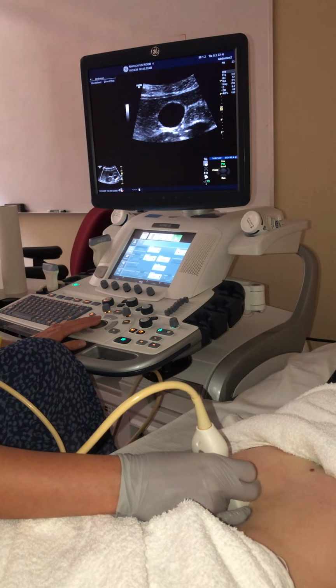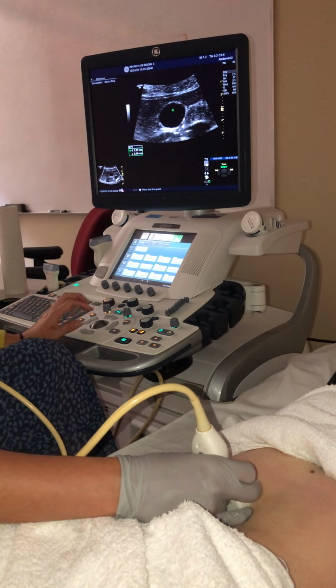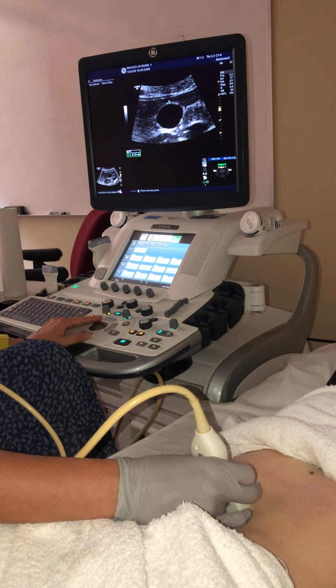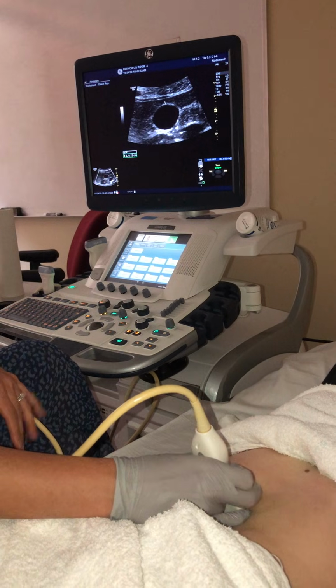We measure the anterior wall outer to outer. We want that less than 3 millimeters. So we're going to measure that echogenic wall, and she's at 1 millimeter, so that's good.